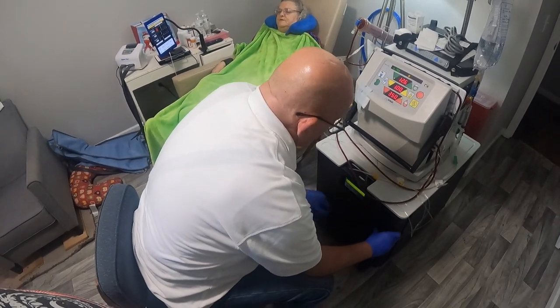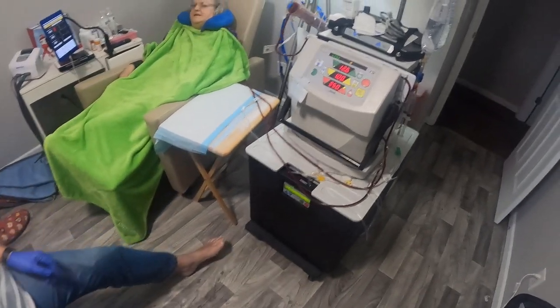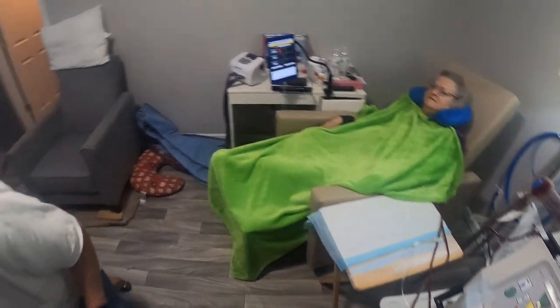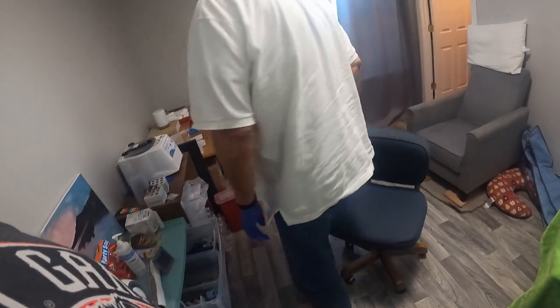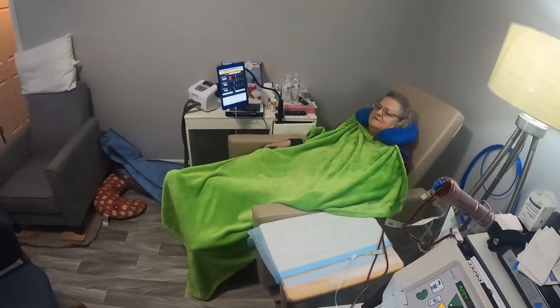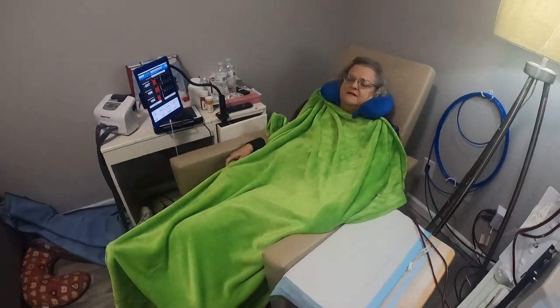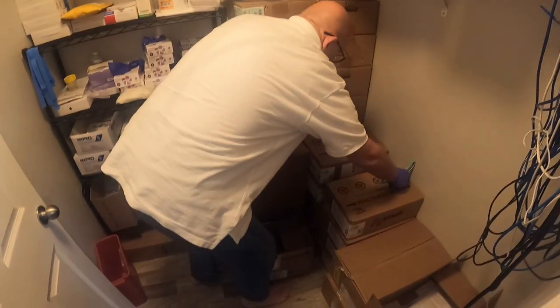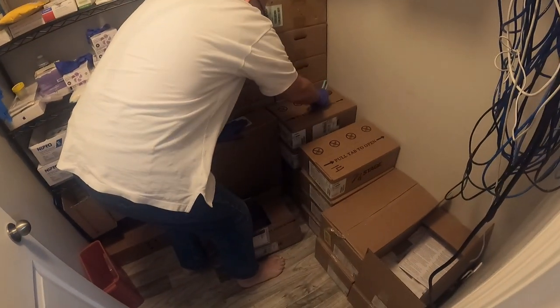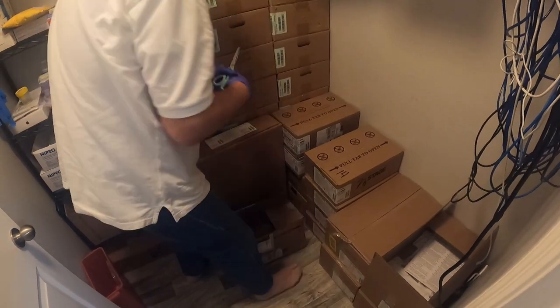It'll warm it to 98, so that it keeps the blood at the same temperature as what it was when it left your body. So let me show you about dialysate. The dialysate starts out.